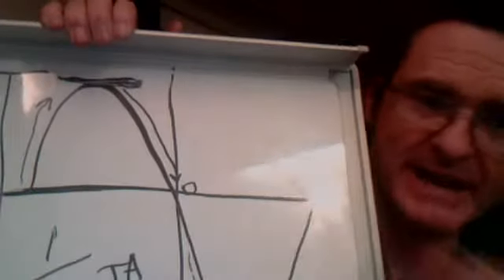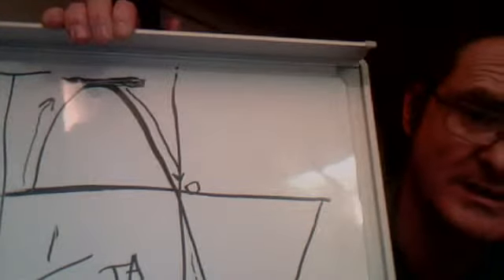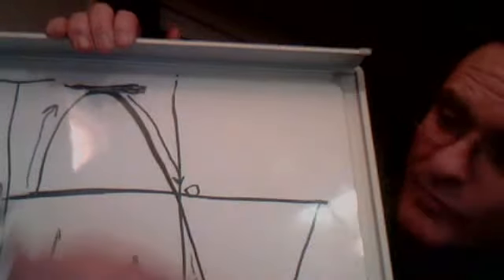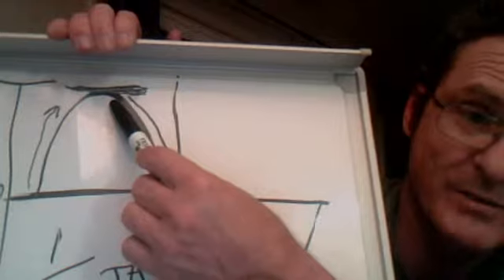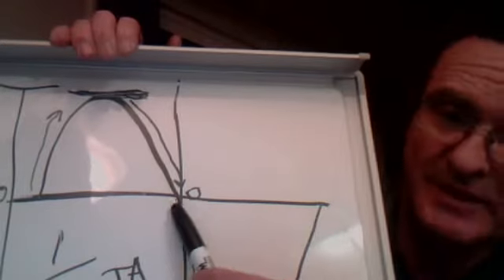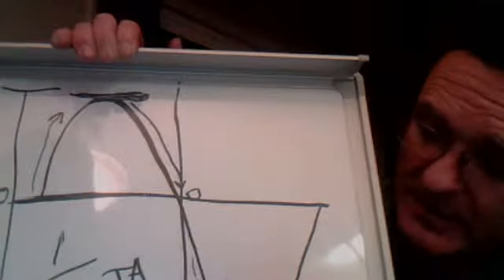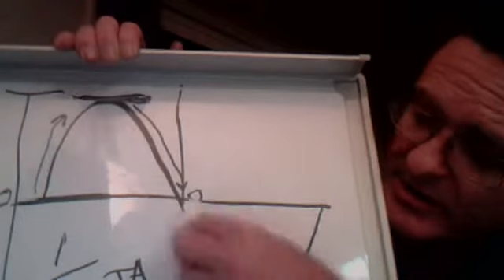the cathode and the anode are only going to have the correct polarity half of the time. The filament actually needs to have a negative charge on it for it to build up enough electrons to send to the tungsten target. So during one half of the cycle, as this generates peak voltage, there are electrons generated from the filament that actually go over to the anode. As it swings back down to the negative, there's very little electron buildup on the filament, so there's no way to generate a beam. Since this is not desirable, the x-ray machine actually has circuitry that eliminates the negative part of the cycle.